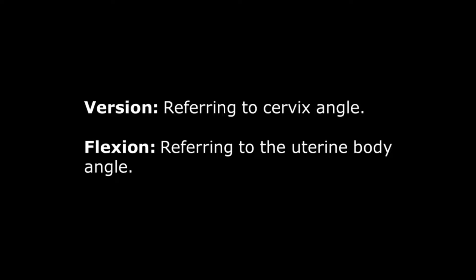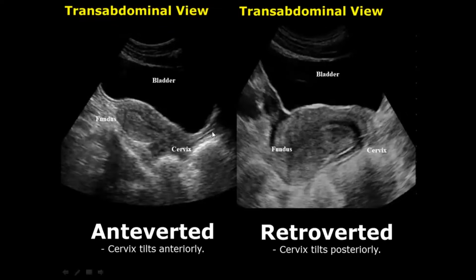When the term version is used, it refers to the angle of the cervix, and when the term flexion is used, it refers to the angle of the uterine body. The first image is the anteverted uterus — it is the most common uterine position in which the cervix faces or tilts anteriorly. There is no bending of the body of the uterus, so we just comment on the cervix.